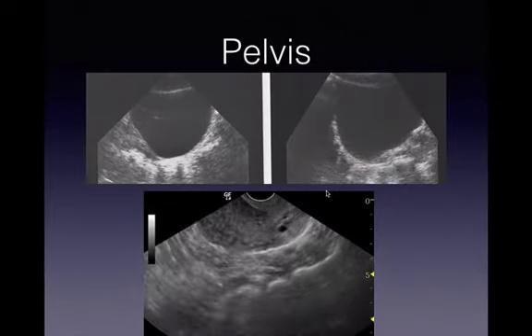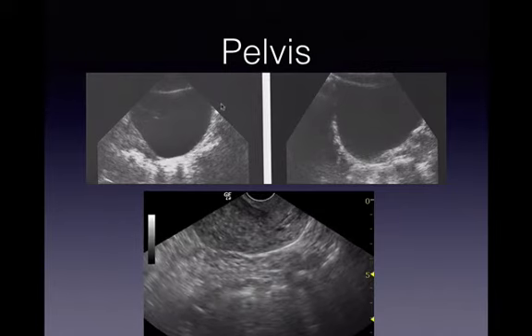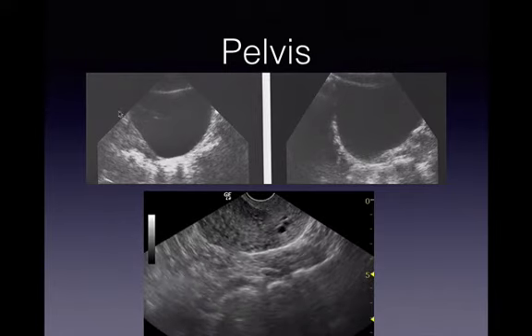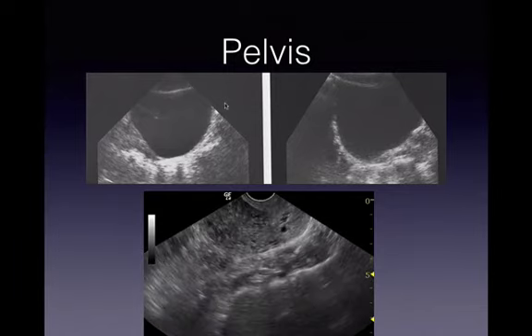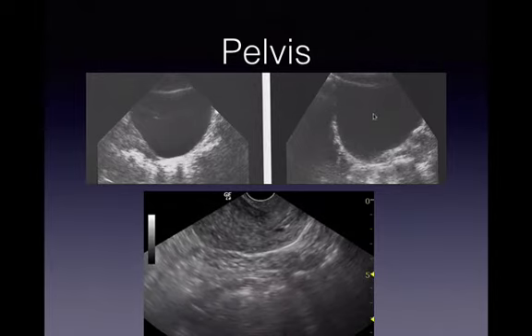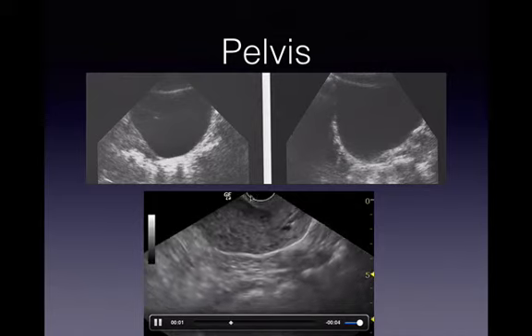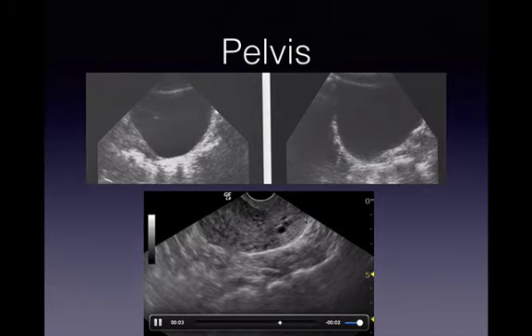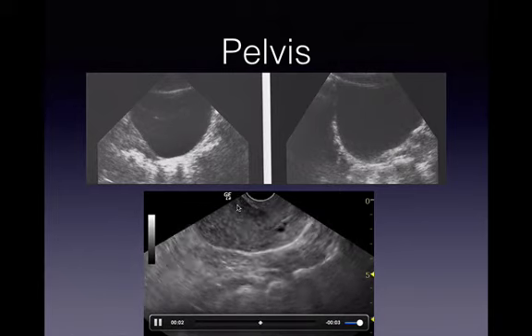When we look at pelvic views, we're going to mostly look at the bladder, and we're not going to be fooled by the internal iliac artery and vein, which will be up here and fluid filled, but they will have significant flow on each side. If we look at a transvaginal view, we can see the uterus close up here is anteroverted, and the bladder is actually quite tiny.